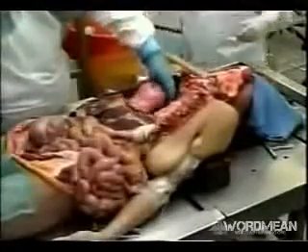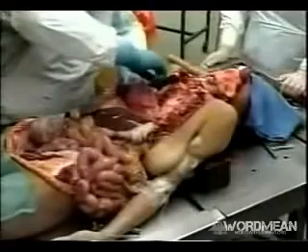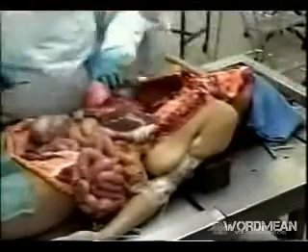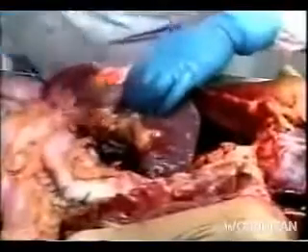Now the heart has been removed. The next step will be to remove the lungs. He's taking the right lung out first. He's cut the bronchus, the main airway to the lung, and noticed that there was some mucoid material in that bronchus. He's now removing the pericardial sac and reflecting the diaphragm in order to free up the liver for removal.